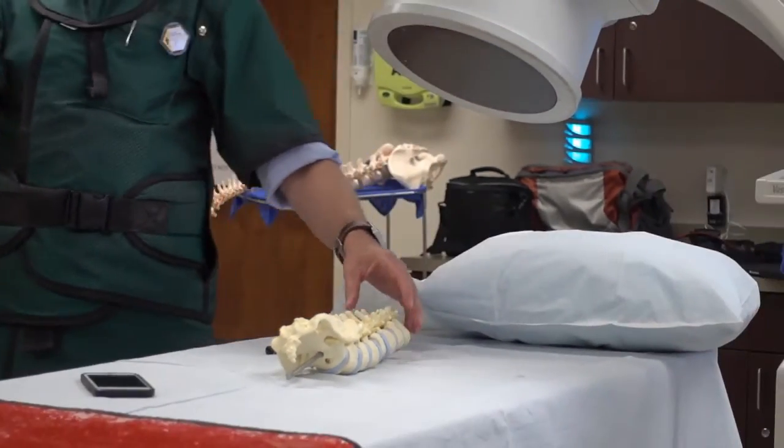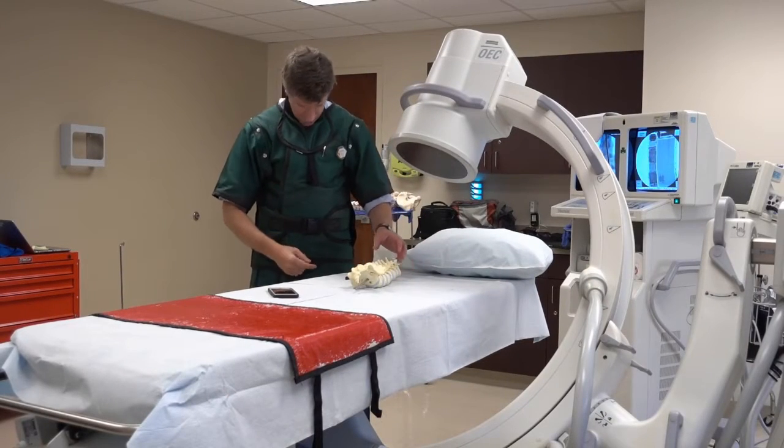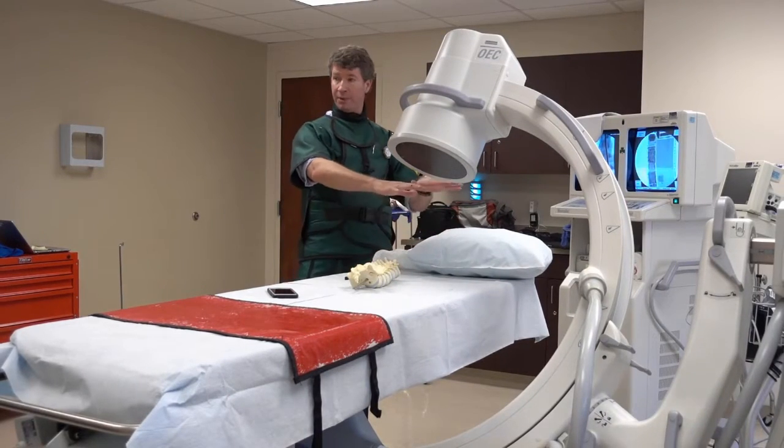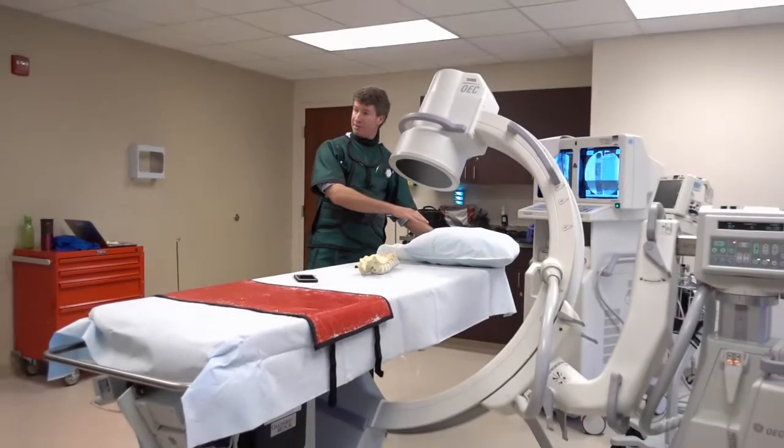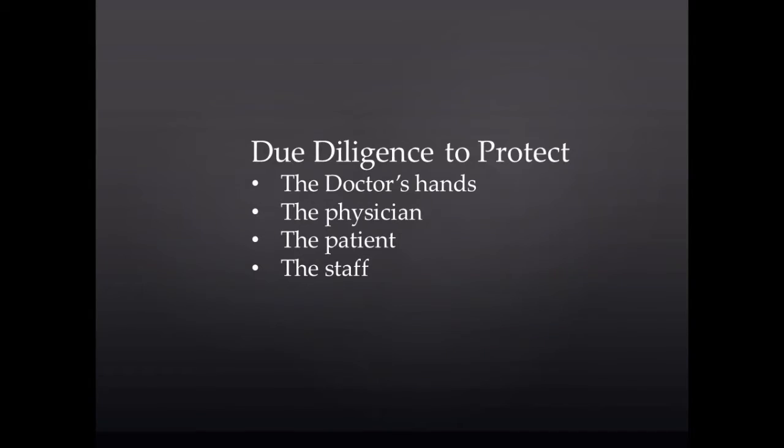Additionally, when we're going to the neck, if we're going to go in between, we want them to flex their neck forward, so we might even build them up here so that they have a place to let their head drop down on the table. That makes it much, much easier. But again, if they have to stay in that uncomfortable position too long, they're going to not do well. Make sure the patient goes to the bathroom before they come here too.